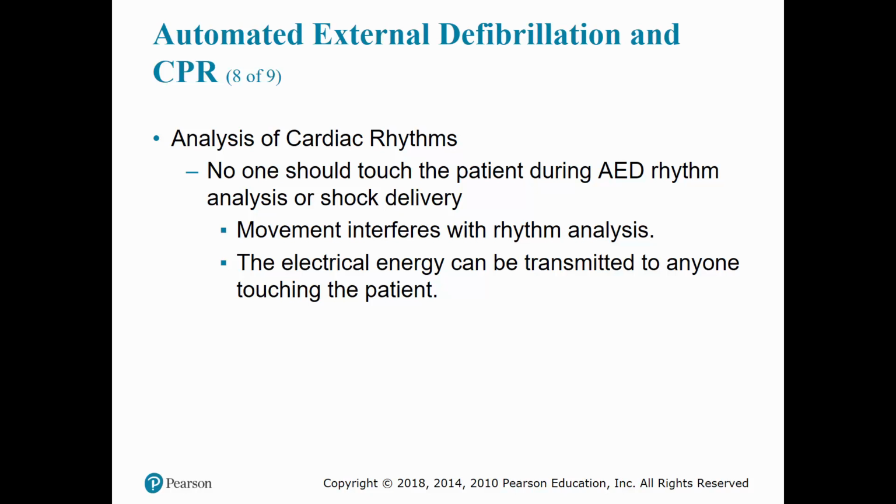Make sure we're pretty dramatic when we say all clear. People throw their hands up, they jump back, but that's good, because you can inadvertently have an arm on them, a knee on them, anything touching them, and that electrical current could be passed through your body. So let's be careful when we're doing this, and also try our best not to touch the patient or move them around a lot when the AED is analyzing that rhythm.